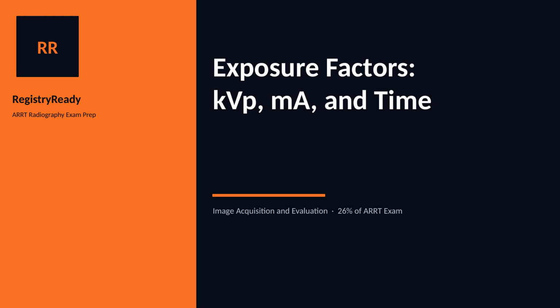Equipment Lesson 10 covers exposure factors: kVp, mA, and time. These are the prime factors you set before every exposure. Every technique decision you make, every number you enter on that console, determines image quality and patient dose.